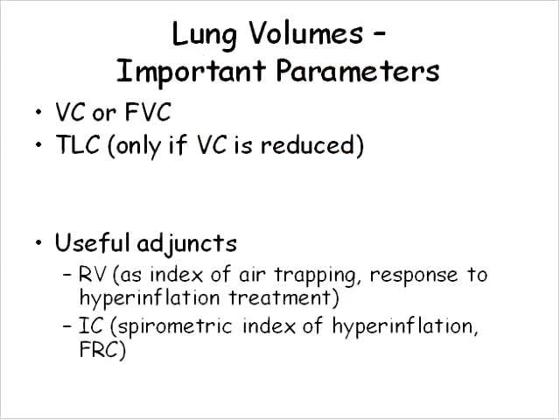Let's go on then and talk a little bit about lung volume measurements. The important measurements are really the vital capacity or the forced vital capacity. If we run into a situation where the vital capacity is reduced, then it may be appropriate to measure total lung capacity. And I suspect that many of you who do complete pulmonary function tests consider the measurement of total lung capacity part and parcel of that.